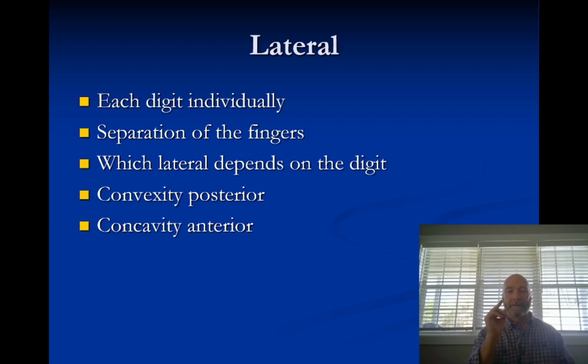So what the ring finger does, though, is it follows the pinky finger. So you can try this on yourself. If you're doing the ring finger, if you're doing fourth digit, it might be a better outcome for you to just extend the fifth digit and just allow the fourth digit to follow it. So separation of the fingers, just make sure you don't get any kind of superimposition.